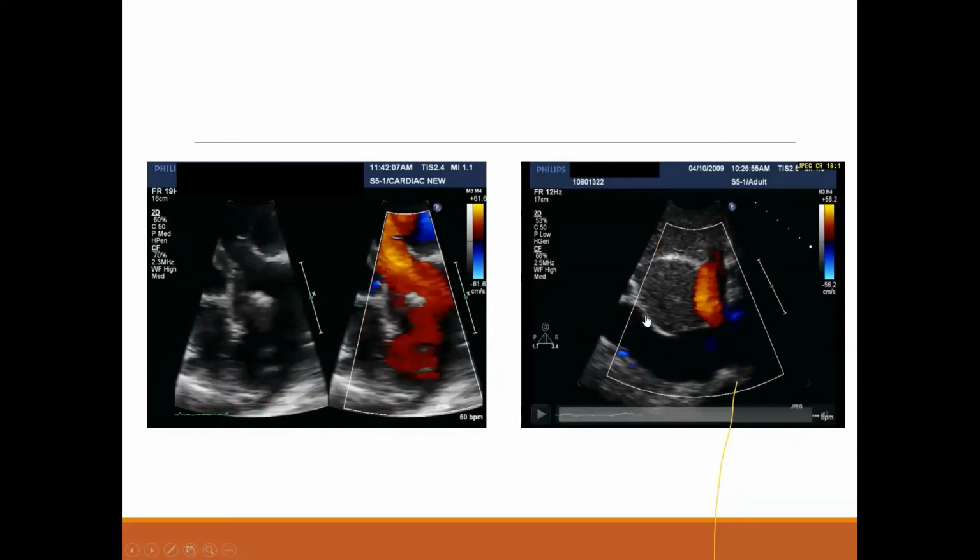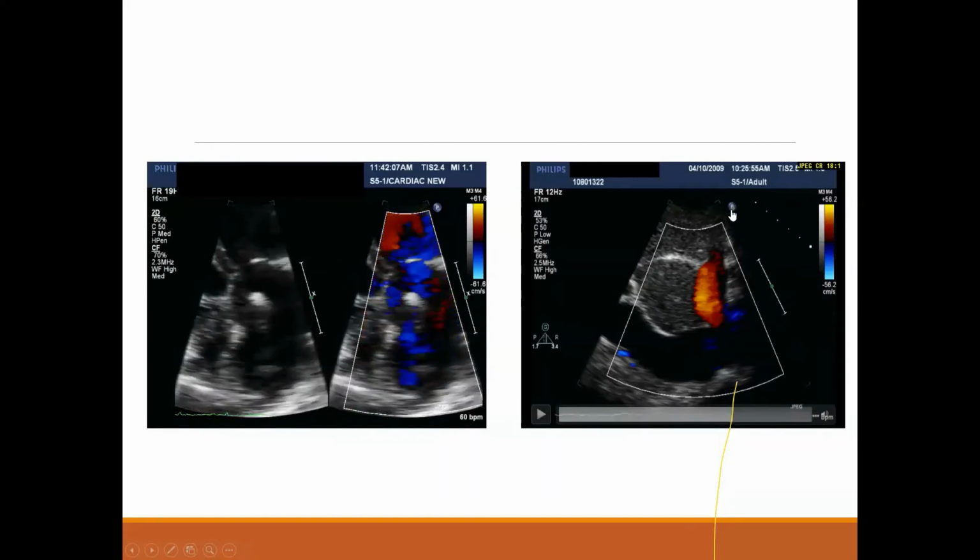Now I'm seeing red color sneaking into the hepatic vein. And this is at what part of the cardiac cycle? Look at the ECG. Systolic. Systolic. Red color means what? A flow going in this direction, right? Red color is towards the probe. Where is my probe? The P here denotes where your probe is. Okay, so the probe is here. So I have color that moves toward the probe.